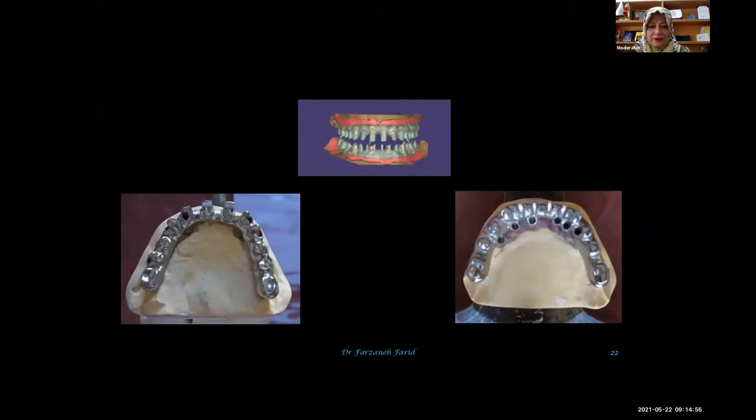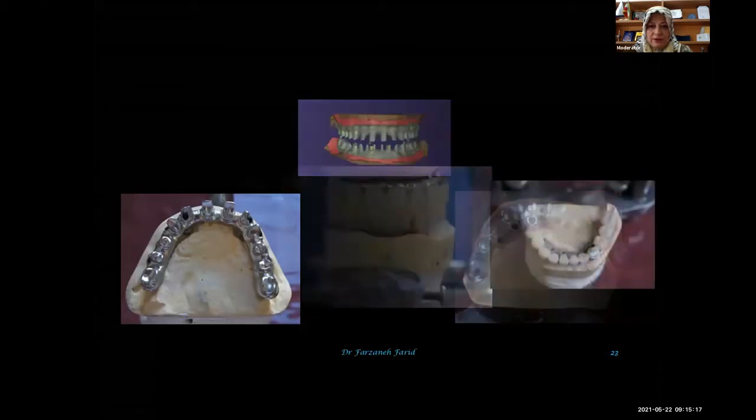You see both substructures from the upper jaw and the lower jaw are in one piece. They are not segmented, and they have no holes other than the access hole to the implant. Doing this with conventional technology is very difficult. I will show you with a slide later.